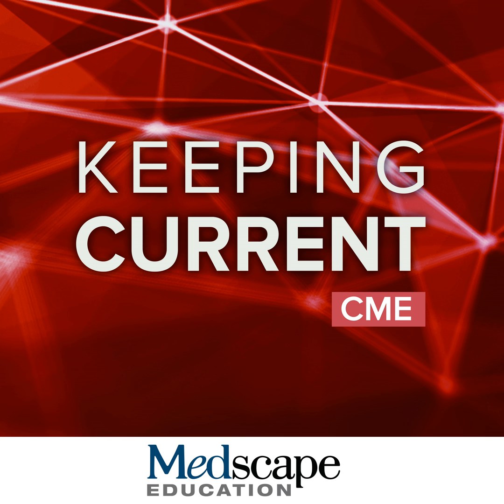The radiographic ARIA severity score is then used along with any clinical symptoms to determine a patient's eligibility for continued drug dosing. In a patient who has no symptoms related to ARIA and mild radiographic ARIA, dosing may be continued. With moderate or severe radiographic ARIA or any clinical symptoms, dosing should be suspended, and monthly MRI is performed until the resolution of ARIA-E and stabilization of ARIA-H.